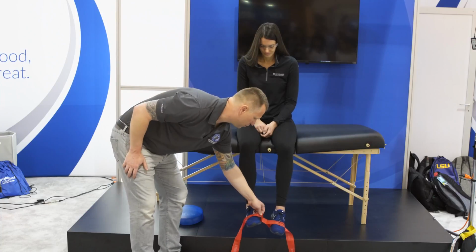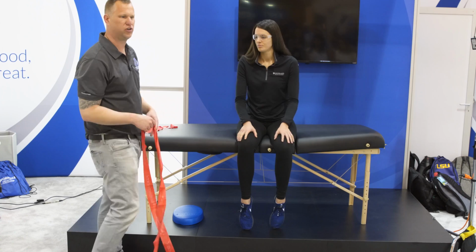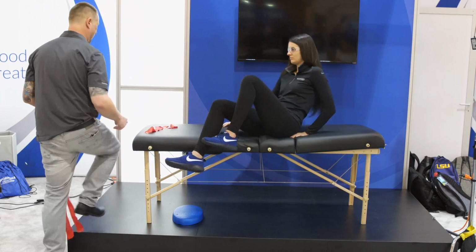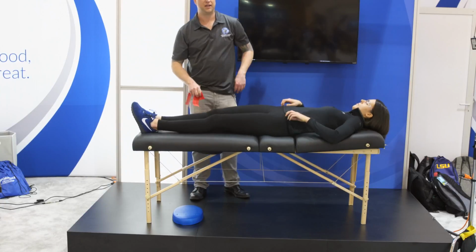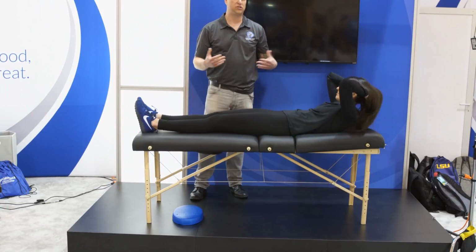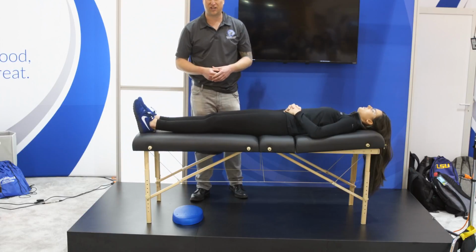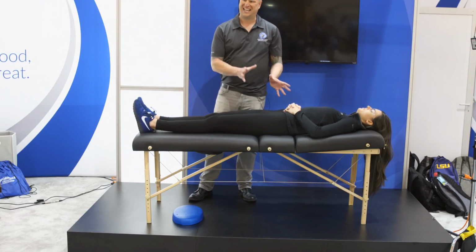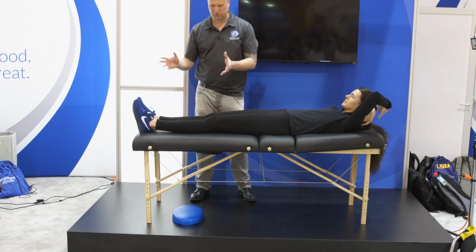Let's slip that off for a moment, and let's go ahead and go into a supine position. Traditional, we'll put Becca's head down at that end, yep. So this is a traditional non-functional position used a lot in the clinic. Because we have mat tables, we're taught to do kind of single plane exercises here. Again, what are we looking at? We're looking at hip, knee pathologies as it relates to transitioning from functional activities.